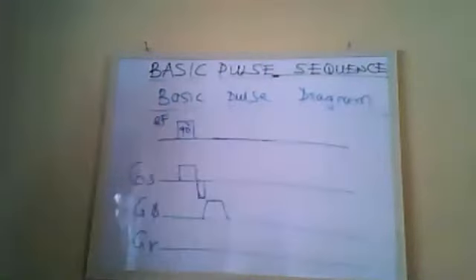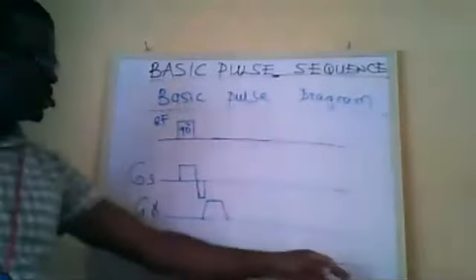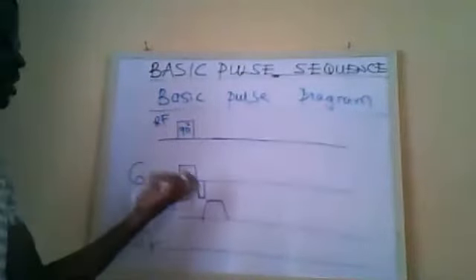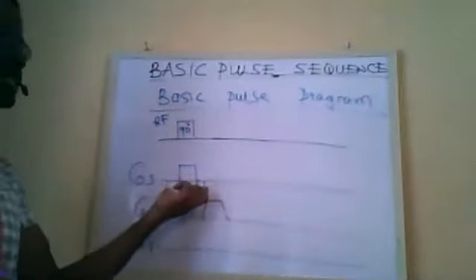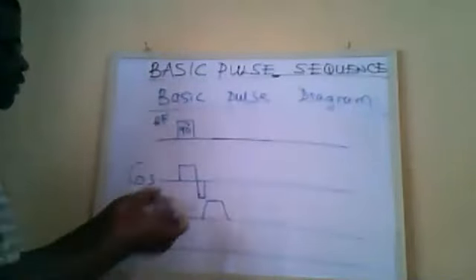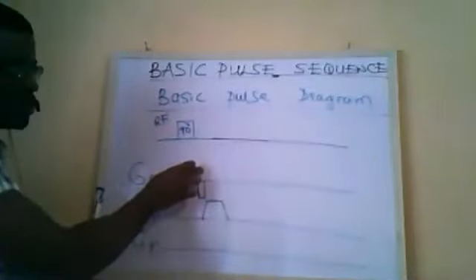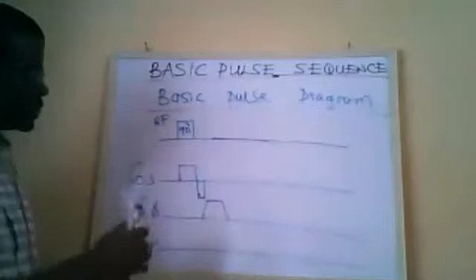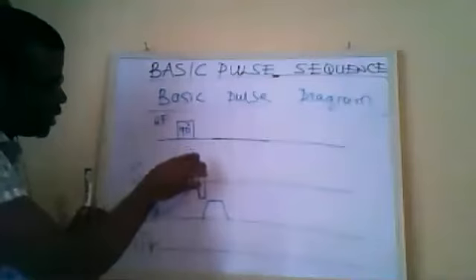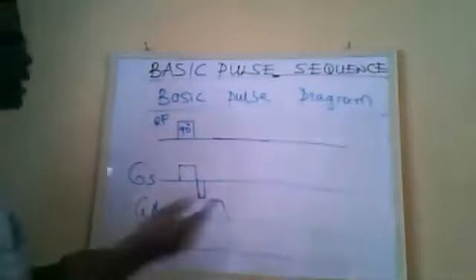This is done such that when we read the image out, it will be within the slice we are interested in. Because if we don't do that, we can actually move into another slice. So this cancels the effect of the gradient you have applied with this pulse. But it is very necessary, because we are interested in this particular slice we have selected.